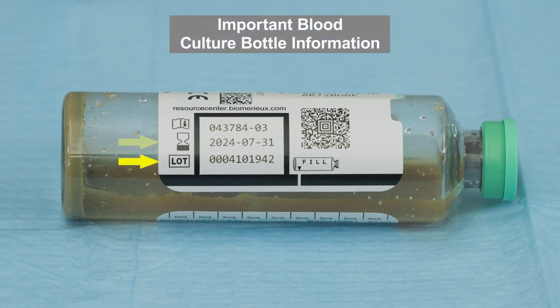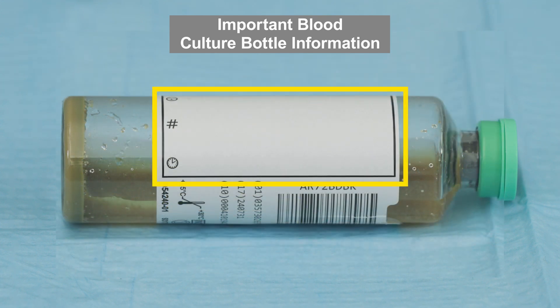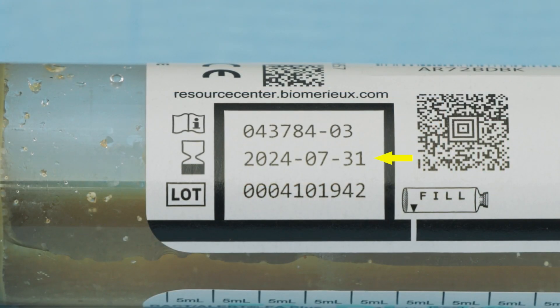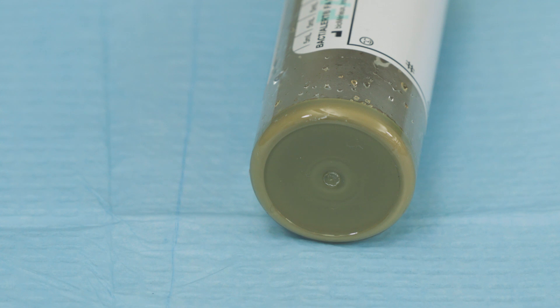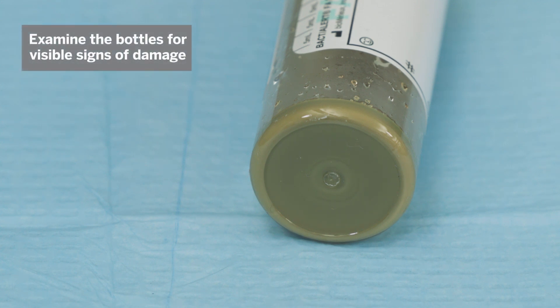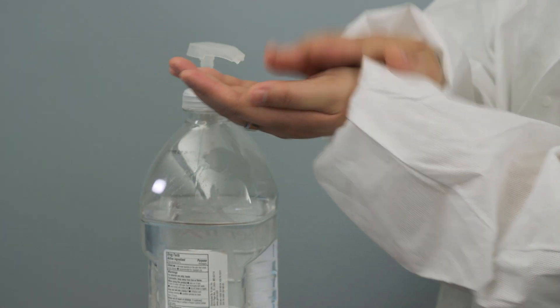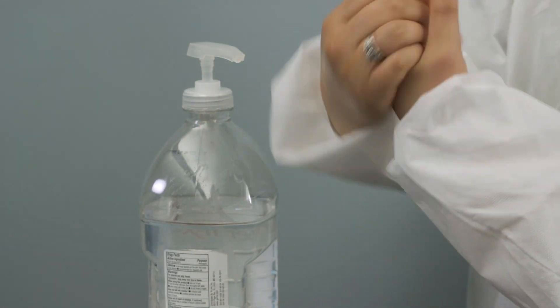Gather all necessary materials. Check the bottle lot number, expiration date, fill-to mark, barcode, black box window for checking the level of blood, and the area to add patient information and test label. Check that the culture bottles are within the expiration date. Do not use a bottle containing media displaying turbidity, a yellow sensor, or any other visible defects. Do not use bottles that show signs of damage, deterioration, or leakage.